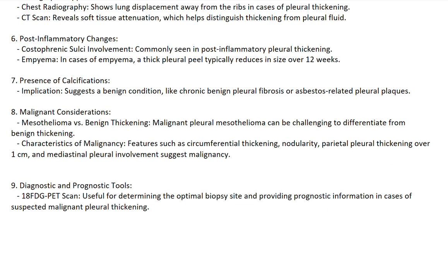thickening. This point-wise summary delineates the key aspects of pleural thickening, highlighting its causes, diagnostic challenges, and distinguishing features between benign and malignant conditions, aiding in effective clinical assessment and management.